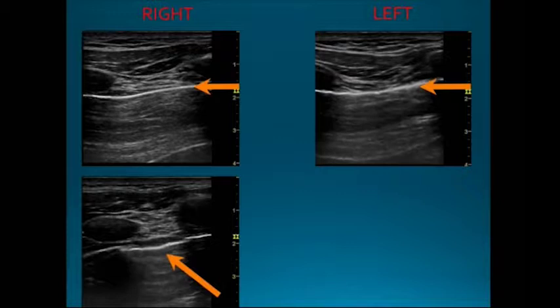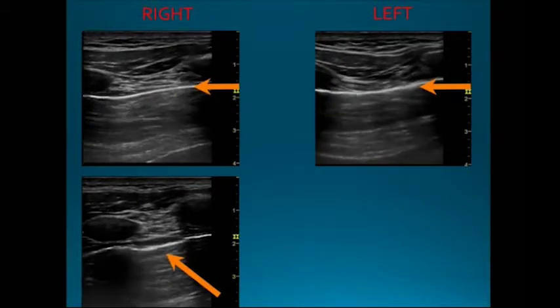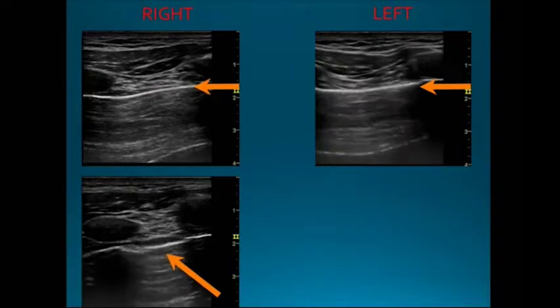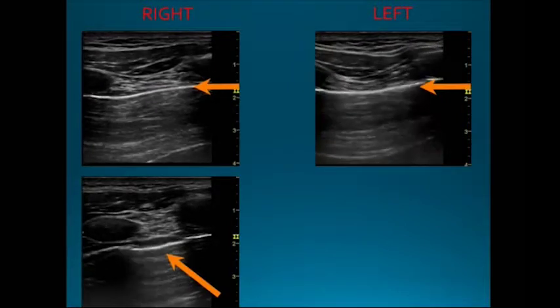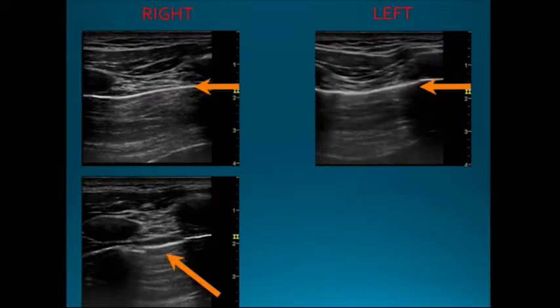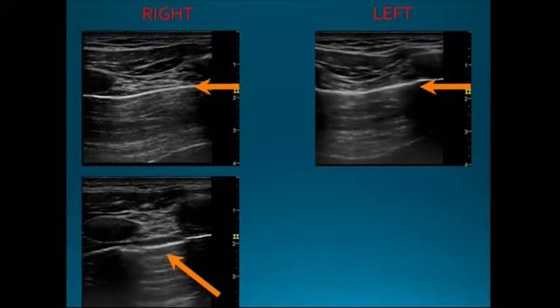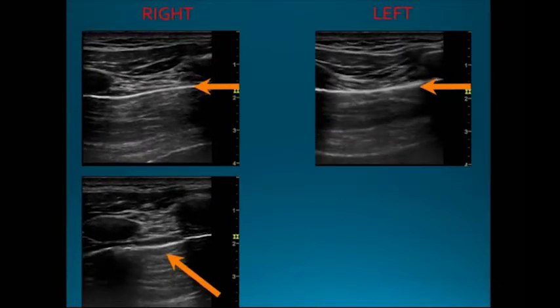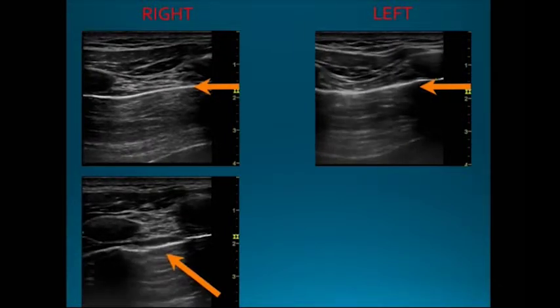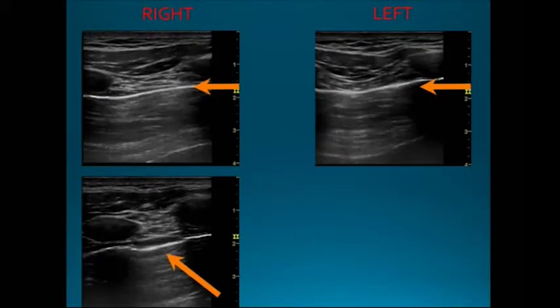They call for a chest tube kit. They put in a chest tube on that right-hand side. Big rush of air comes out. The patient sort of rapidly, the tachycardia goes away, the blood pressure comes up. You know, they had a tension pneumothorax, and they kind of rapidly save that person's life. Meanwhile, about 20 minutes later, the x-ray tech is coming in with the portable x-ray machine, kind of, hey, do you still need this? No, we don't need it.